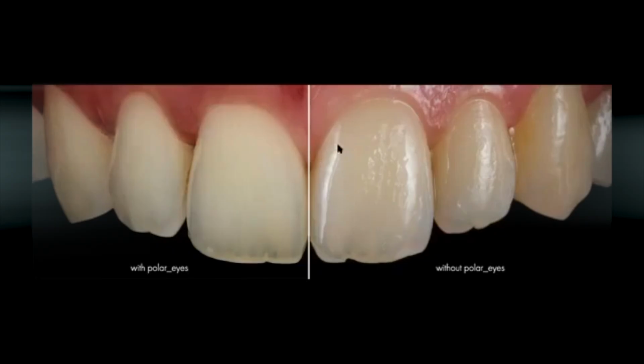highlights, because the highlights are too strong. The rest of the tooth looks darker. So that's one of the effects when we apply the polarizer. We can immediately see that the tooth looks actually much brighter. And this is the reality, because we don't have the specular now to really contaminate our measurements.